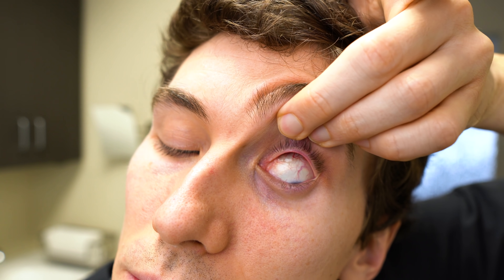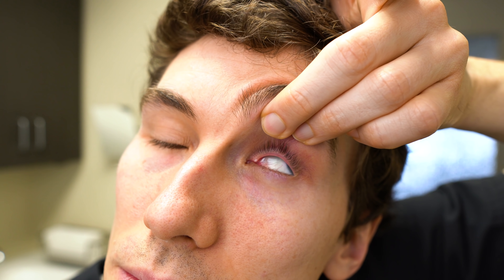For a contact lens stuck underneath the eyelid, that's a slightly different situation. If you have anything stuck in the eye — whether it's an eyelash or a contact lens — blinking frequently can help. It gets your eyelid moving and the eyelid can eventually push things out; that's just the natural function of the eyelids.